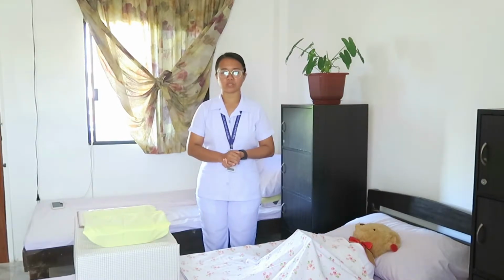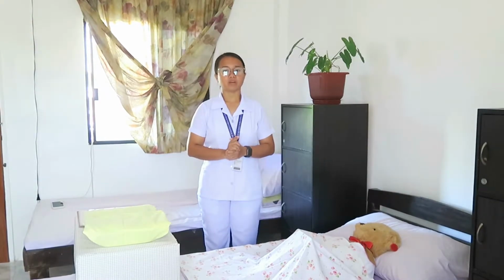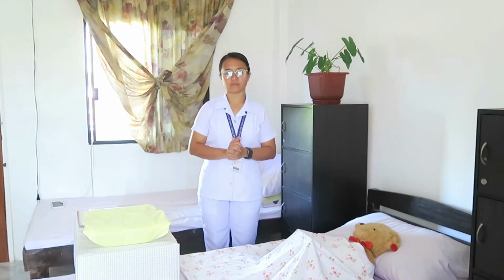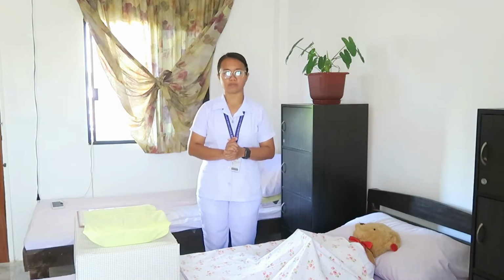from Davao Doctors College. And for today's return demonstration, I am going to perform the female urinary catheterization. But before we proceed to the procedure, let me explain what is catheterization. Catheterization allows urine to drain from the bladder for collection. It may also be used to inject liquids used for treatment or diagnosis of bladder conditions. Also, it is the introduction of a catheter through the urethra into the bladder for instilling or removing fluids.